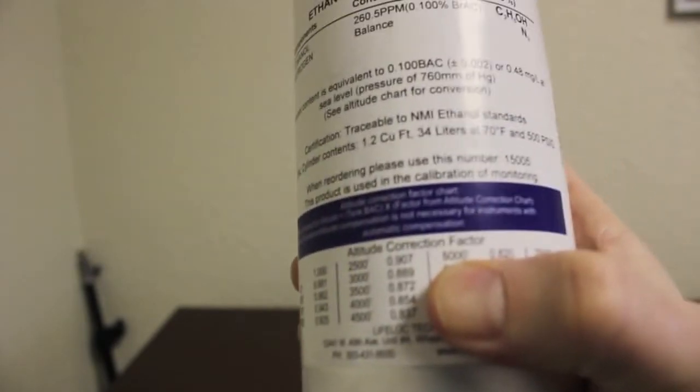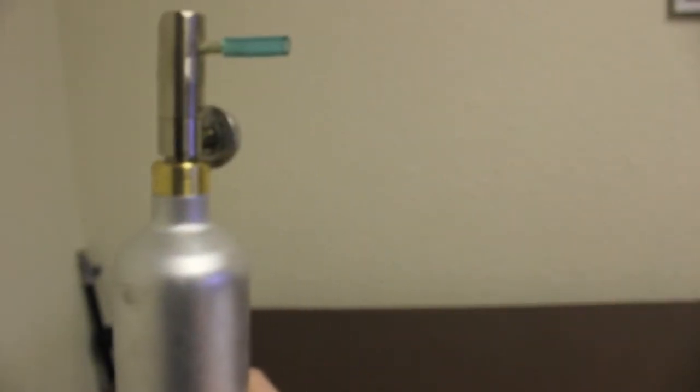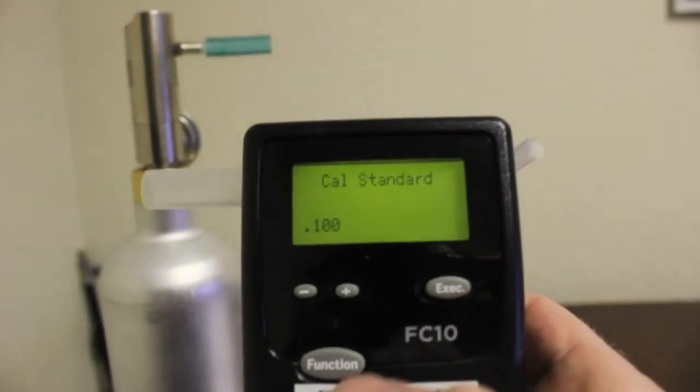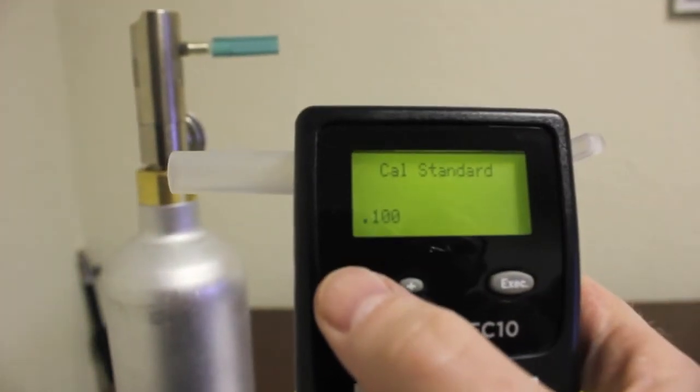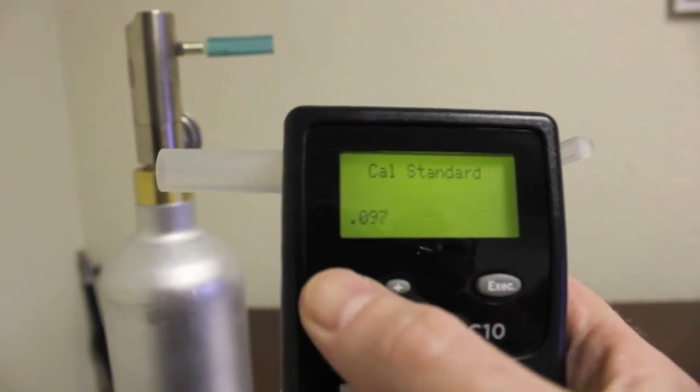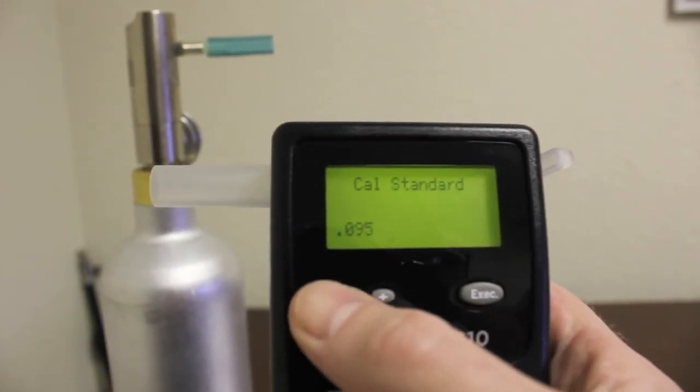Because we are at elevation, we need to adjust our Cal Standard. Find the value for the elevation closest to your location and multiply it by your Dry Gas Standard. In this case, our altitude is 5000 feet, so we'll multiply .820 by our .100 standard to get an Altitude Correction factor of .082.